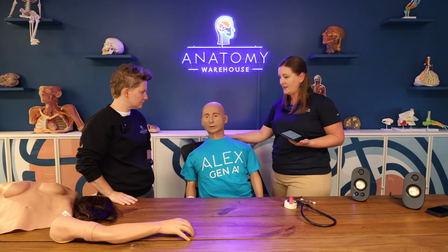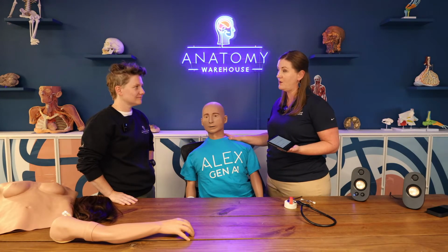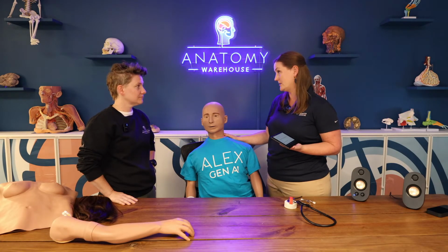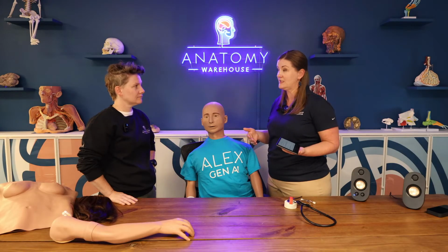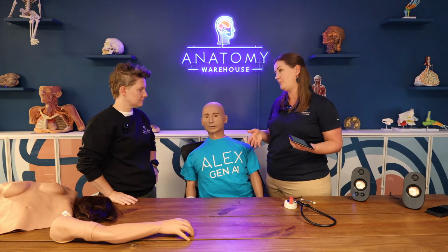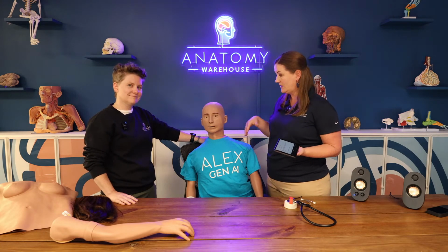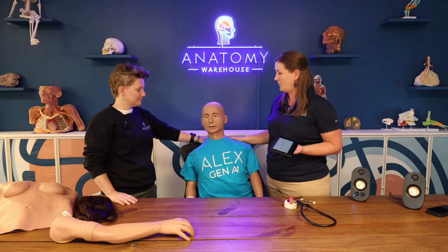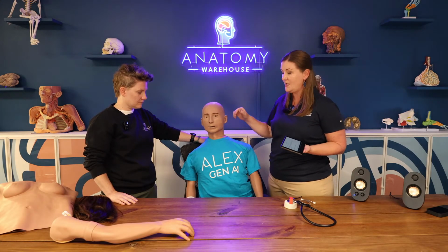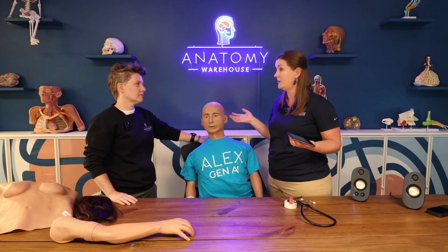Nope, just that Alex is a flexible, portable mannequin. He ships for about 67 pounds, so he folds literally in half in his case, which makes him easy to transport and position in different spaces. Of course, sitting up, the iris cam always looks the nicest, but he can absolutely be put on a floor. He's wireless, he's tetherless, he connects to the internet wirelessly, so he is his own Wi-Fi router, and he can do all those things very seamlessly, and he's relatively lightweight. The bulk of his weight is from his hips up to his head, but his legs are very flexible, and he's capable of being positioned in situ wherever he needs to be.